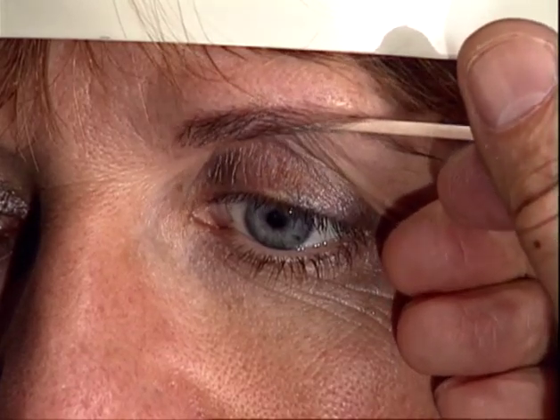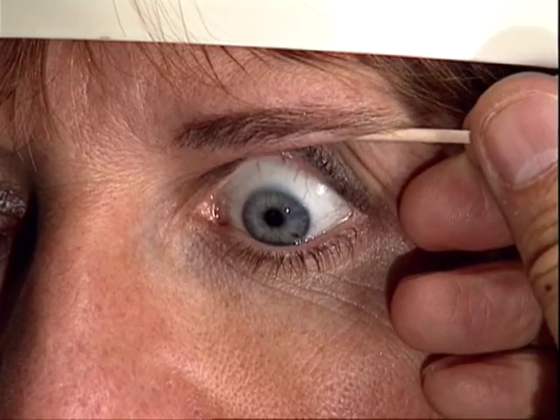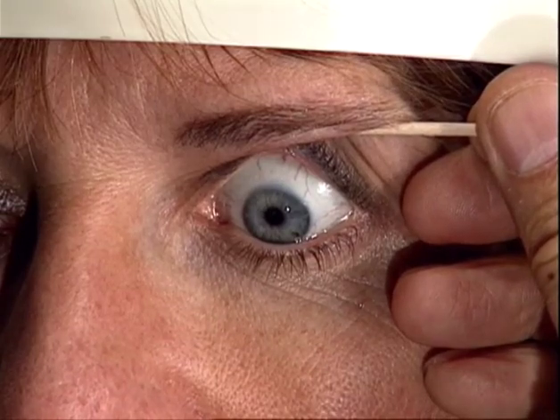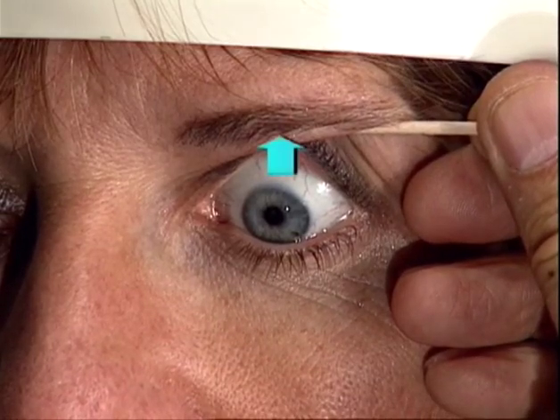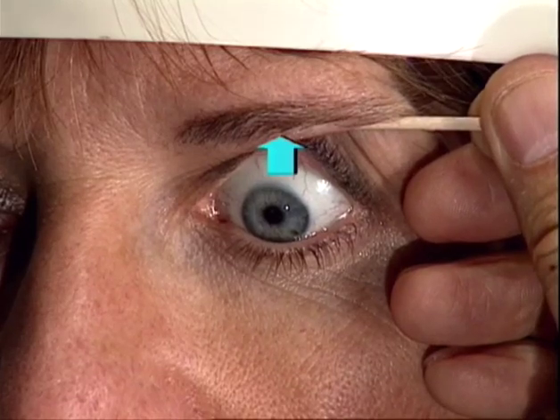The required lid movement is achieved by just rotating the cotton tip, which by this rotation pulls the lid upwards. Please keep in mind, while rotating, the tip is pressed always away from the orbital contents, that is, against the bone at the orbital rim.